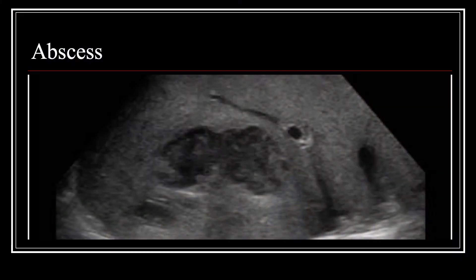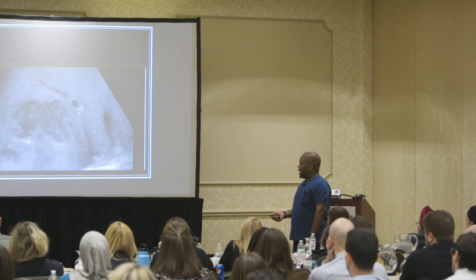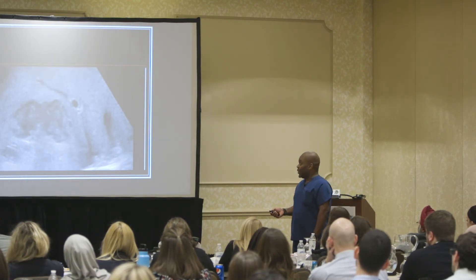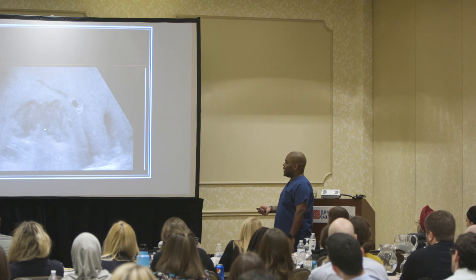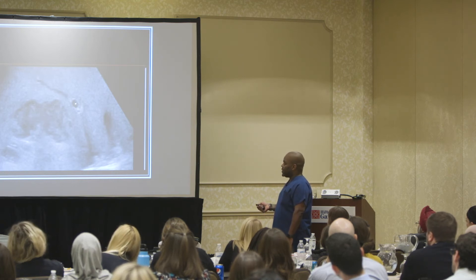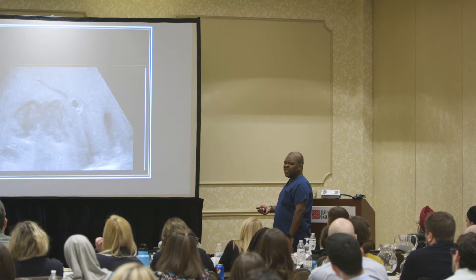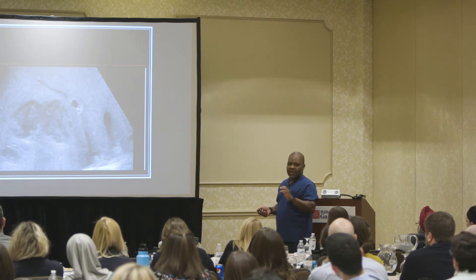Here's a different situation — a guy who spent five days in Taiwan eating and drinking whatever he wanted, then a week later comes in with high fever and right upper quadrant pain. You pop the ultrasound on and see a liver abscess with an irregular border. You don't just put a needle in there and drain it — you admit this guy and let the proper people take care of him. You can document it as an intrahepatic irregular abscess. You can see it's not nice and clear and black like a blood vessel — it has proteinaceous material inside, so you know it's an abscess and not a cyst.